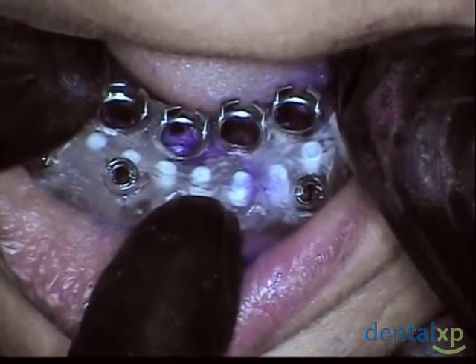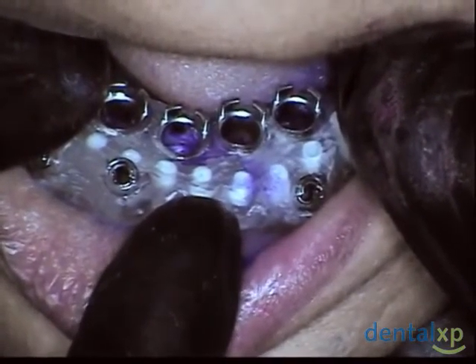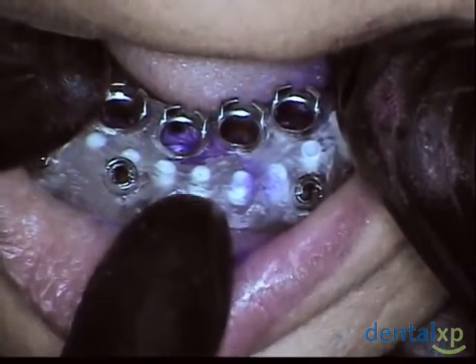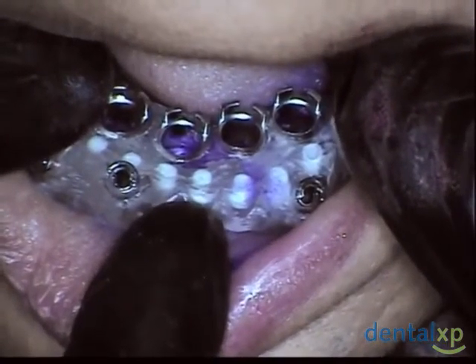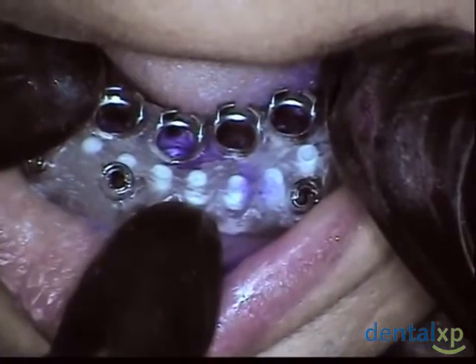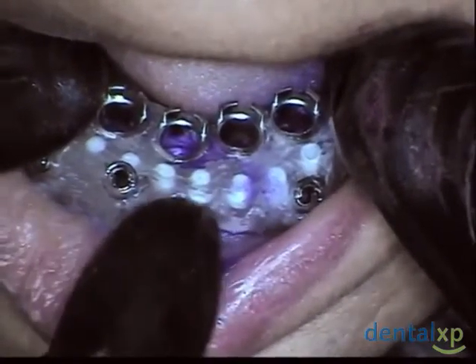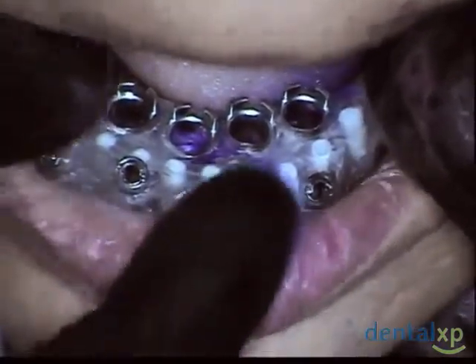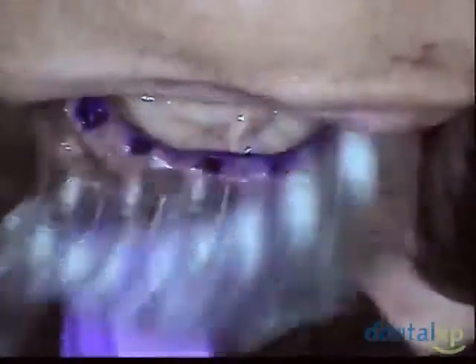In many cases we can do a flapless or modified flapless procedure. Things that dictate whether we can go flapless are: do we know where the structures are that we want to avoid, and do we have adequate attached tissue after the implant is placed. If those two are checked off positively — you know where you don't want to be, such as the neurovascular bundle, and you have the implants away from that area — then it's simply going in and placing the implants without subjecting the patient to producing a flap and sutures. We've marked through our guide where the implants are going to be placed.